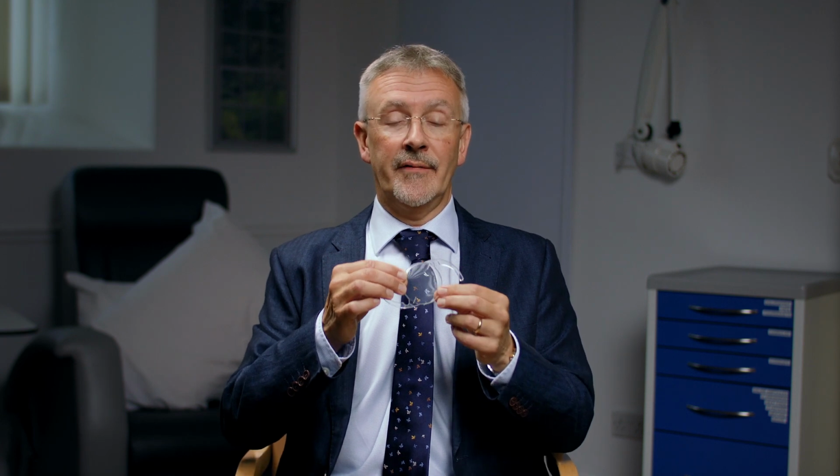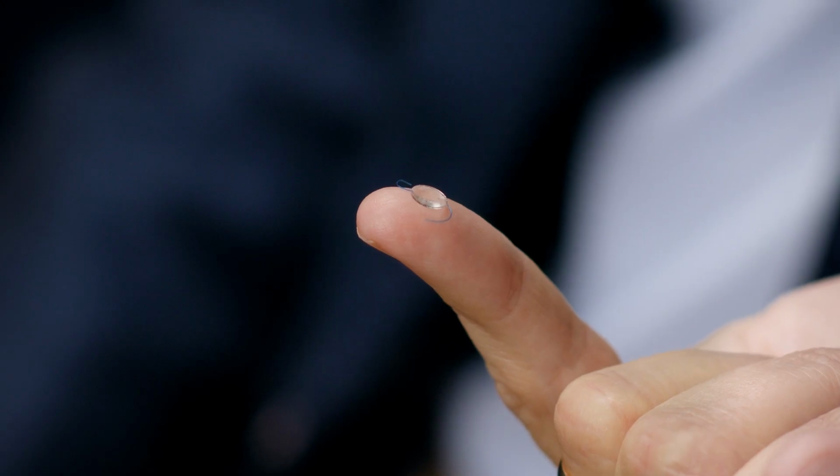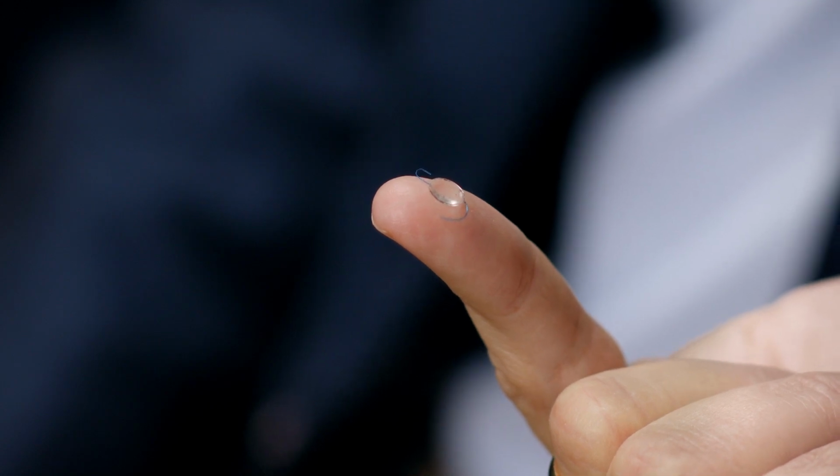What are the different types of lenses used during surgery? Here's a model example of a lens implant. A real implant is so tiny it would fit on my fingertip. Monofocal lenses are the most common type. They provide clear vision at a single focal distance, which is typically set for either distance or near vision. If you choose a monofocal lens for distance vision, you may still need reading glasses for close-up tasks.